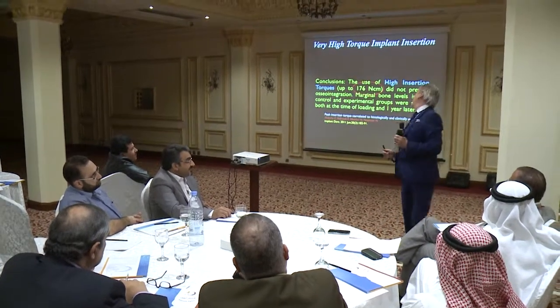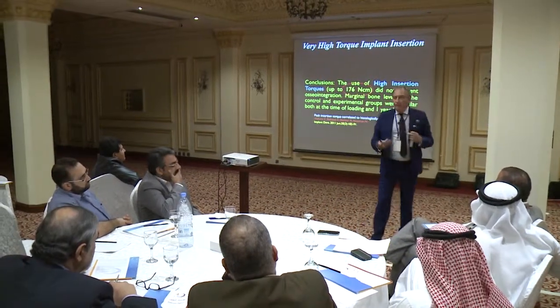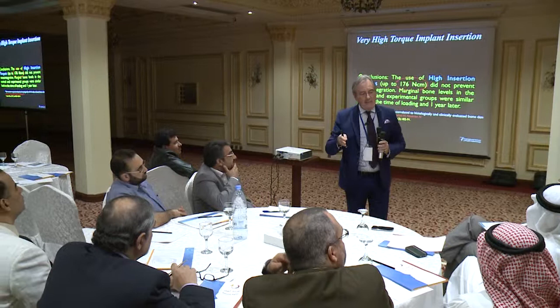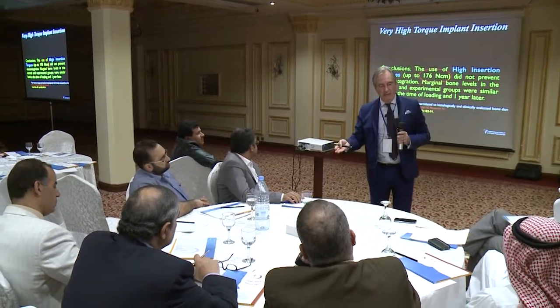It doesn't mean that for all your implants you have to place 176, otherwise all your patients will come out of your practice like this because of the force you apply. But it's possible. And personally, I give you my personal experience. Most of the cases, I'm applying more than 110.